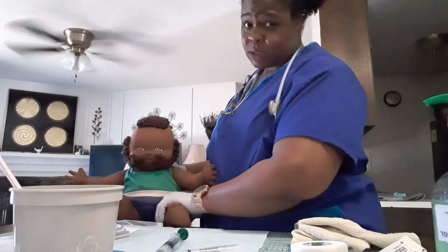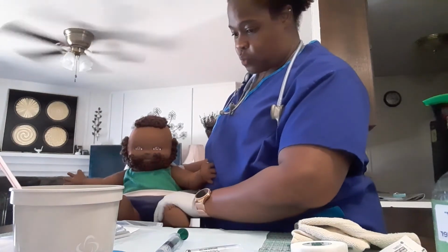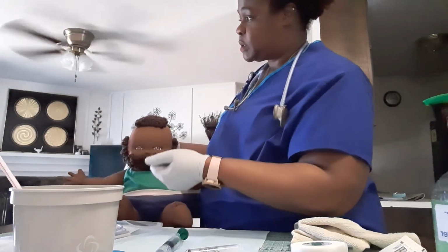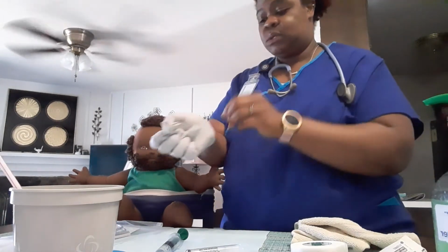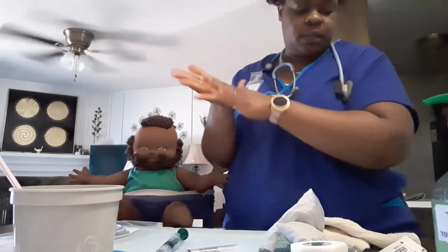I'm going to assess the patient's comfort and pain at this point. He said he feels so much better. I'm going to lower the bed, lock the bed, pull the side rails up as needed, call light within reach. That's it. I'm going to document my findings. I'm going to take my gloves off, and I'm going to perform hand hygiene.